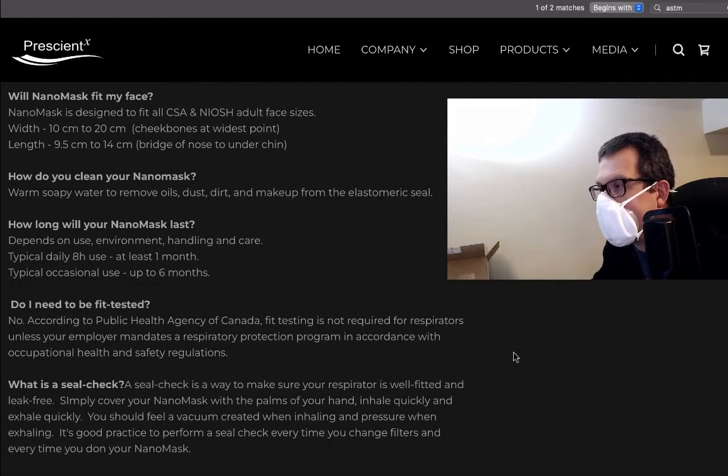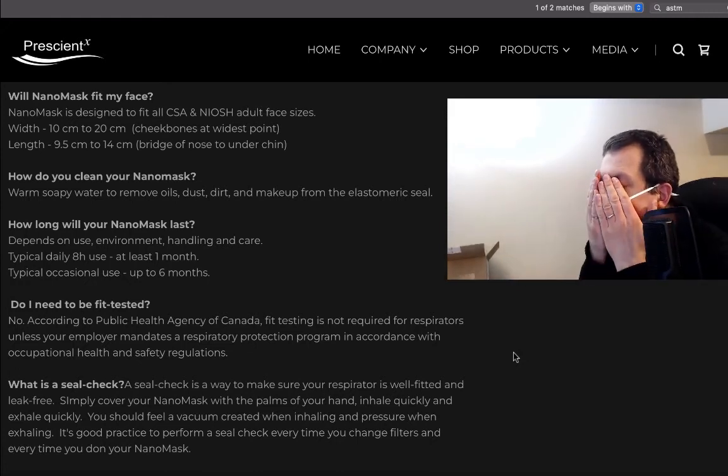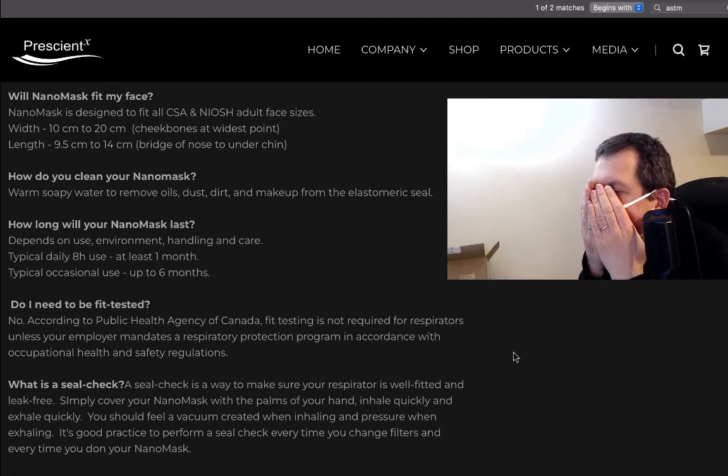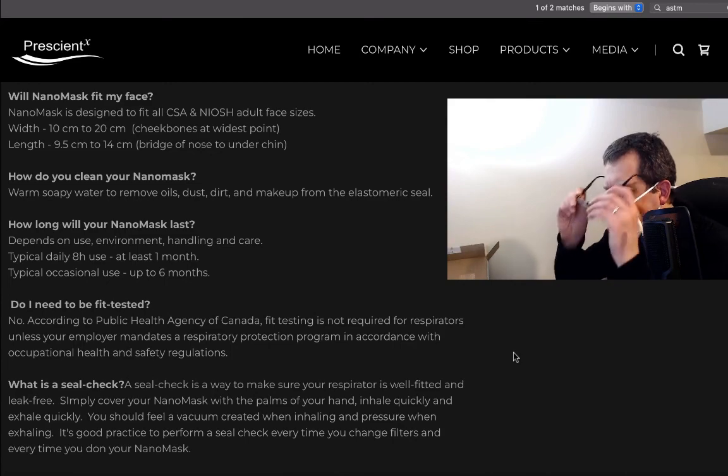A seal check is a way to make sure your respirator is well fitted and leak free. Simply cover your nanomask with the palms of your hands, inhale quickly and exhale quickly. You should feel a vacuum created when inhaling and pressure when exhaling. It's a good practice to perform. I can feel that vacuum being formed — looks good, feels right.